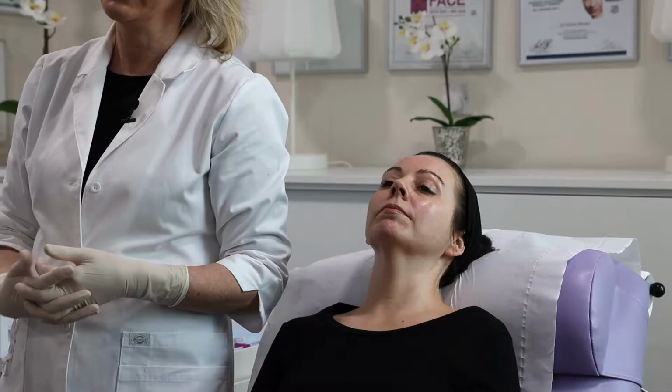They deflate, they move inferiorly, and particularly the nasolabial fat pads become heavier inferiorly. She's lost some definition in her deep malar fat pad and also in her SOOF. She's additionally got some heaviness of her nasolabial folds, and she's got some facial asymmetry, which we'll help correct with her filler treatment today. We're not going to do contouring in the temples. This is something I might do at a later stage, but we're really going to focus on the CK codes. We'll be doing the tear trough codes, and we'll also be improving her nasolabial folds.